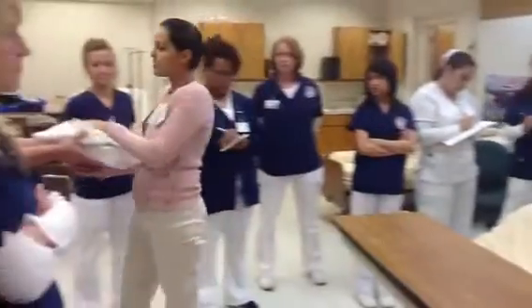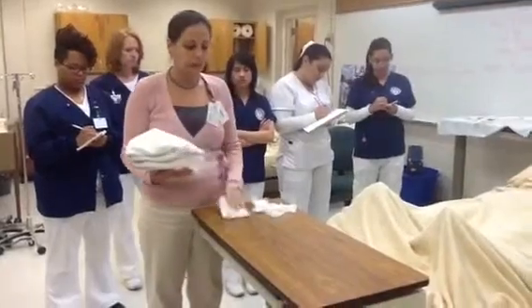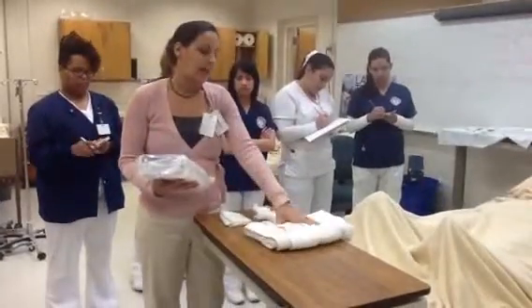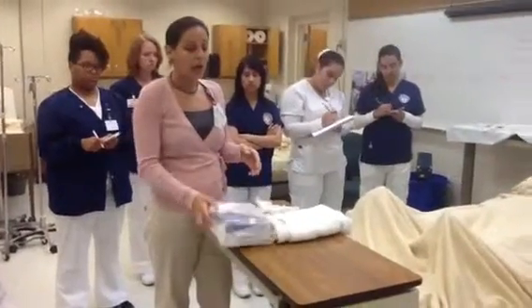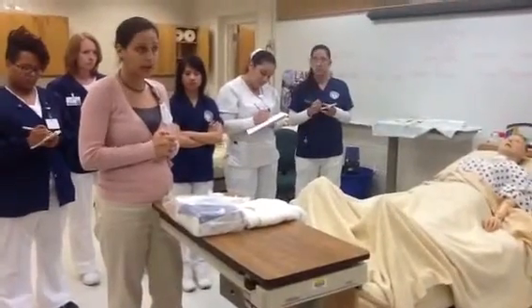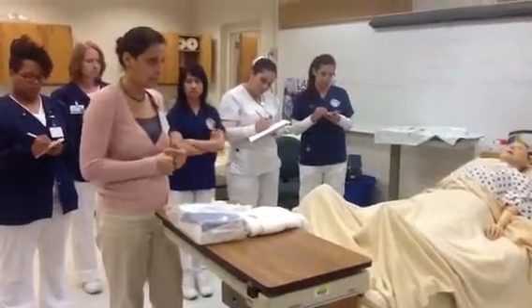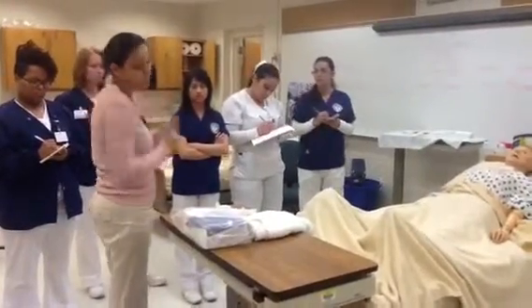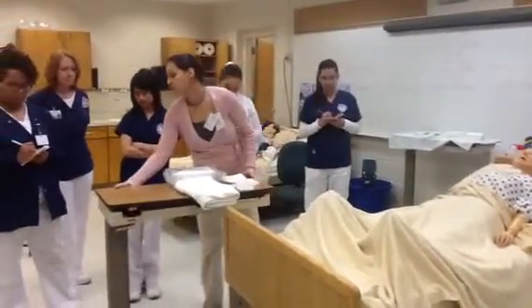And then I gather my supplies. My supplies include clean gloves, a barrier to lay under my sterile field, a towel or chuck to lay under my patient, and my Foley catheter kit. If I already know that my hands are not going to fit inside the gloves inside this catheter kit, then I'll have secured an additional pair of sterile gloves before I enter the patient's room. But I can work with these, so that's fine. I'll perform hand hygiene again and go ahead and set up some of my items here.